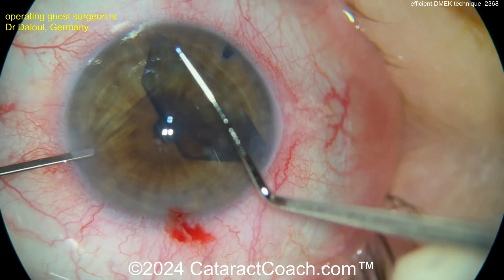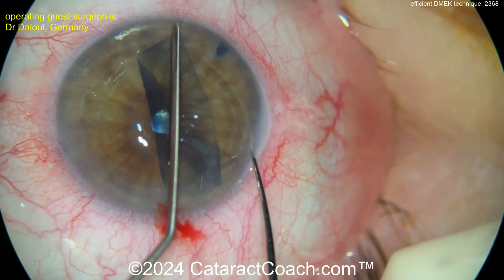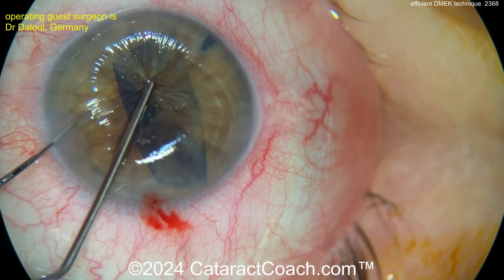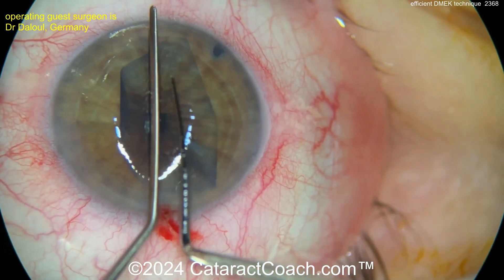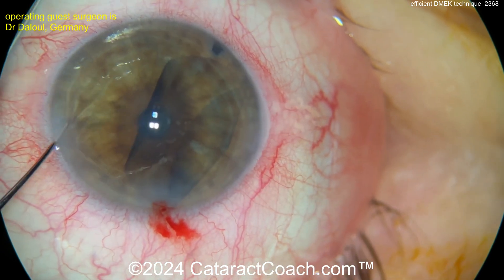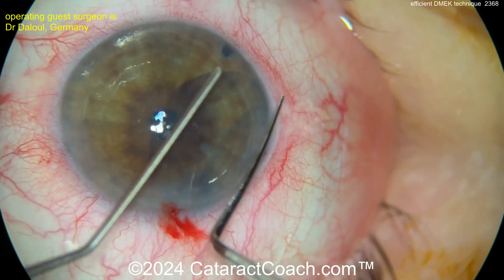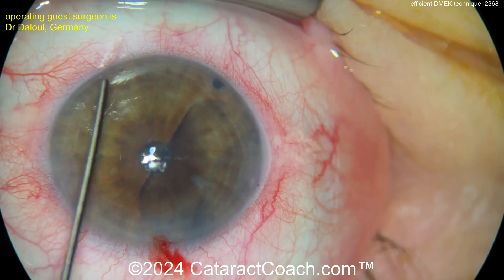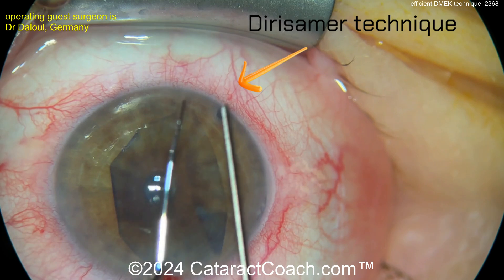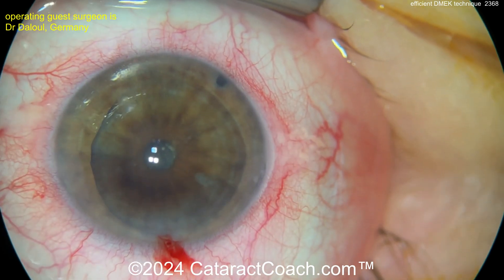There are many techniques and many ways of doing a DMEK surgery. Certainly it's well within the realm of a cataract surgeon to learn how to do this — it's not completely foreign to them. You have the great skills and the great hands. Opening this up and using those two spatulas to just tap and open it. Sometimes I just use two BSS cannulas, 27-gauge cannulas, and then you can really get this opened up just where you want it. As it opens up, there it is — beautifully centered. Derasimer technique. Beautiful.